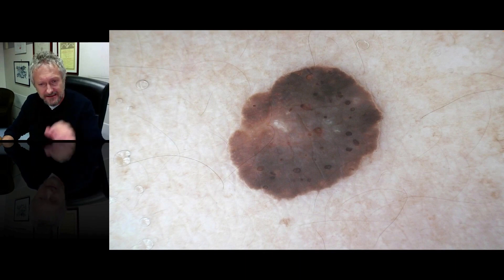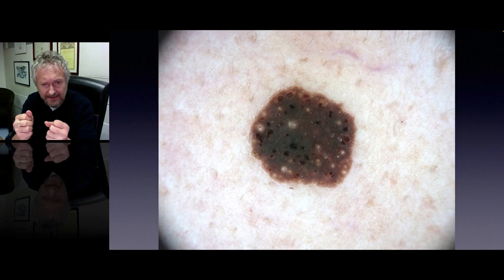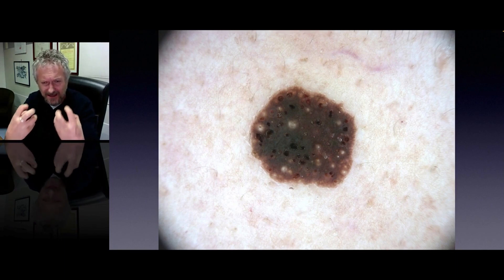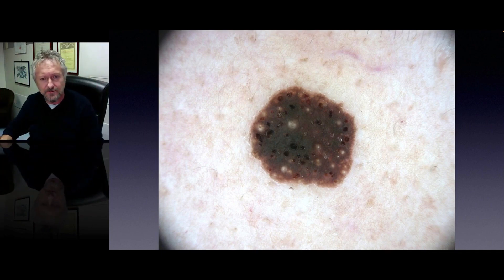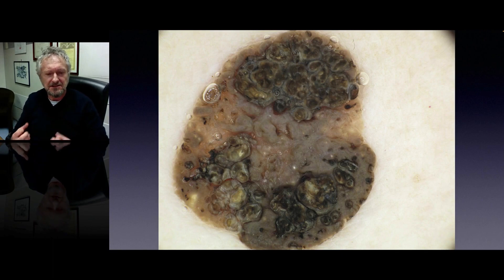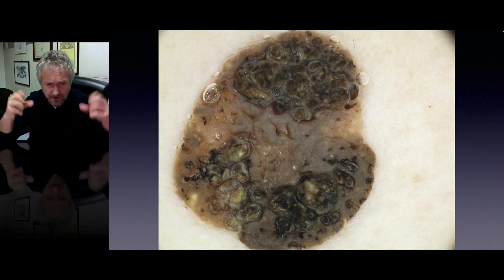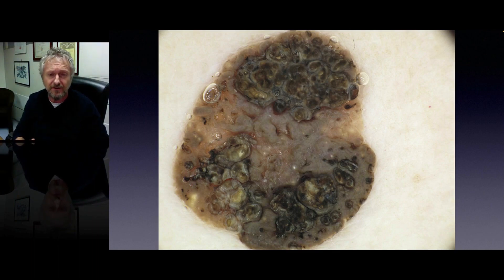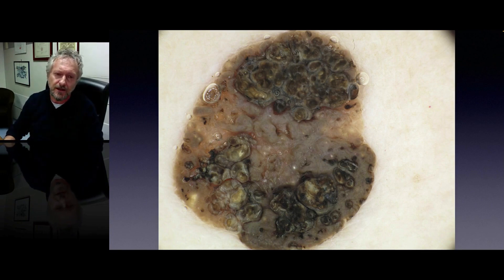This lesion has these concentric, black, sharply demarcated clods. Here is seborrheic keratosis where you see mostly milia-like cysts — white shining dots and clods — but also comedone-like openings and sharp demarcation. Look at another quite verrucous seborrheic keratosis where you see yellow keratin, a lot of big comedone-like openings, and sharp demarcation of the periphery. Here the overall architecture is not so regular anymore, but still the specific clues make this lesion clearly recognizable.